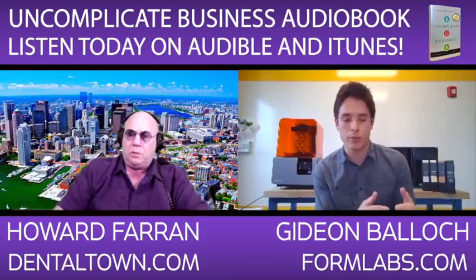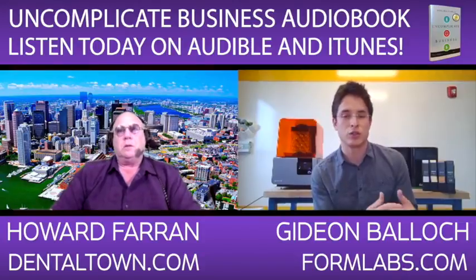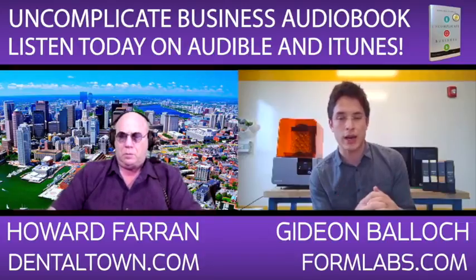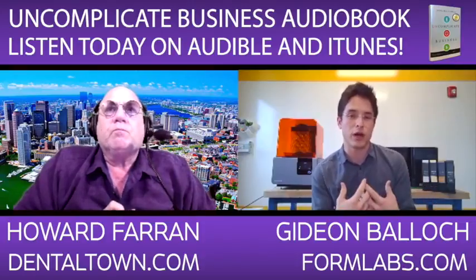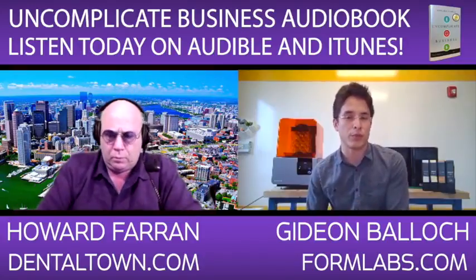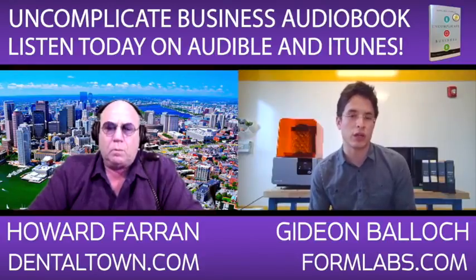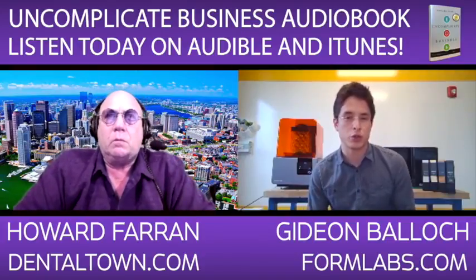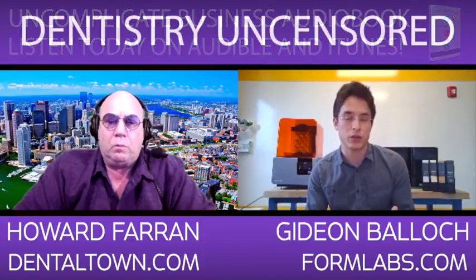And so there are a number of different design companies out there that offer design services only to users that are interested. What Full Contour does is they're a digital-only lab. They'll work with anyone who wants to get a digital file back. They'll help take your digital files, design the treatment alongside you, design a prosthetic, and then send you that file for printing. There's another company that's very similar called 360 Imaging that does it specifically for surgical guides. They'll work with the doctors to plan the surgical plan, design the surgical guide itself, but then send the file back to the user to actually print.